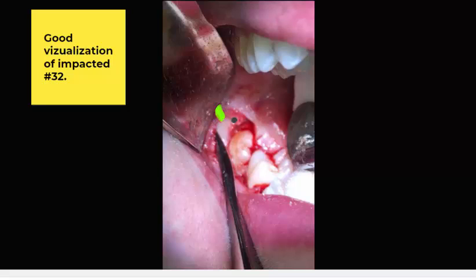This is buccal bone right through here. I'm going to do my buccal bone trough along the buccal of number 32. You can see my little papilla release right here. I don't strip that all the way down to the facial bone of the mandible — I'll just pop it loose. I'll make a little incision with the 15-blade to release some tension and get better access. You can see the outline of number 32 pretty well right here to do what I need to do to get that tooth out.